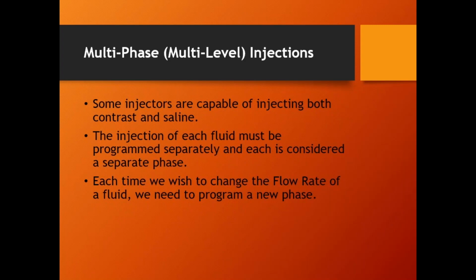So let me make this 20, and I'll make this 5. I'm going to shoot a flow rate of 5 milliliters per second and a volume of 20 milliliters, and that's one shot. I'm going to arm my injector. I'll talk about that in a second. I'm going to say, yep, I checked for air, even though there's nothing but air in here, but it doesn't know that.